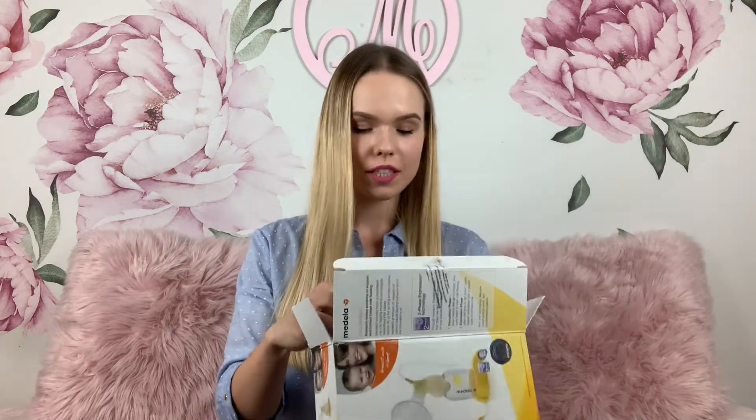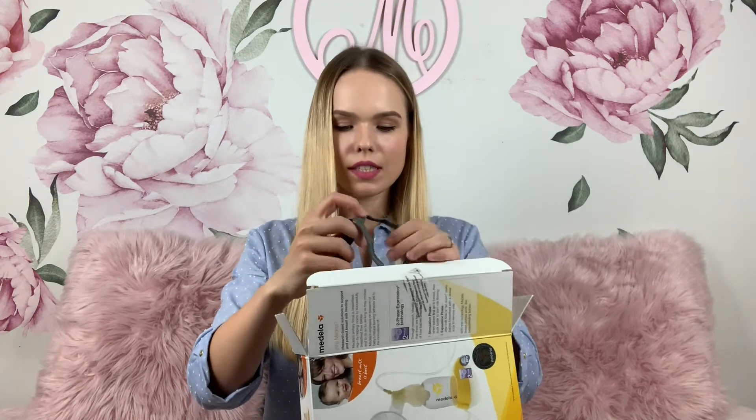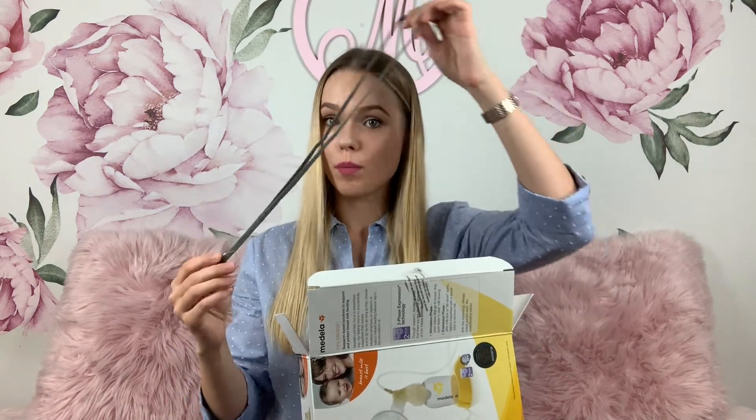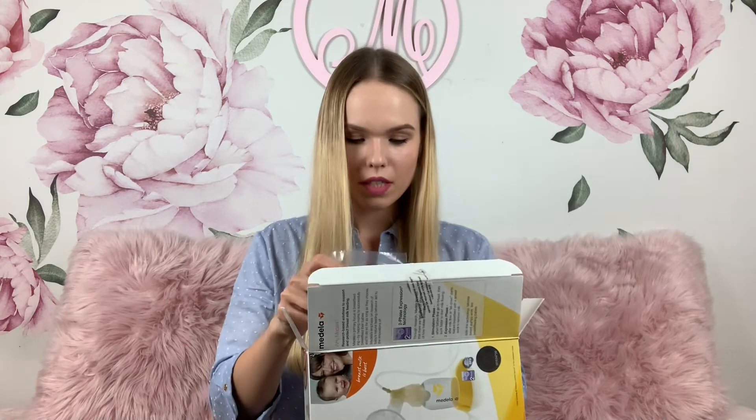Just make sure not to tilt or overfill your bottle while pumping. Now let's see what else came in the box. Here is an extra bottle with the lid. This is a drawstring bag — you can store all the parts in here. This is a strap that you can attach to the motor. The motor also has a clip that you can attach to your belt so you can literally pump and go.